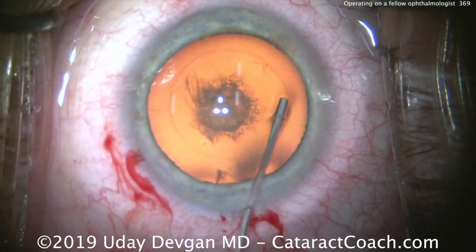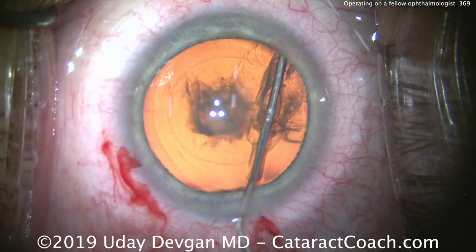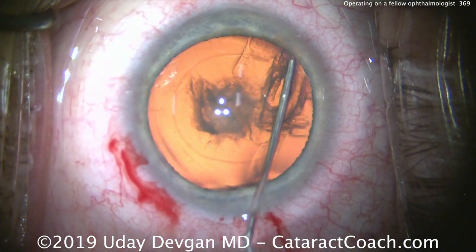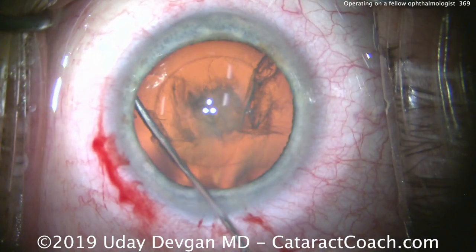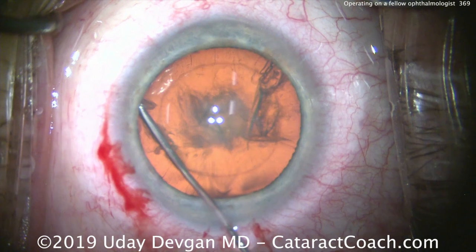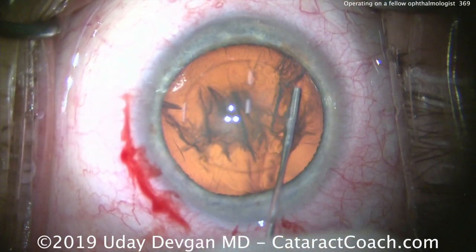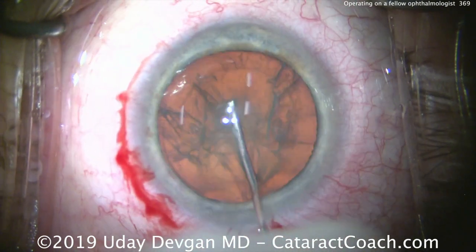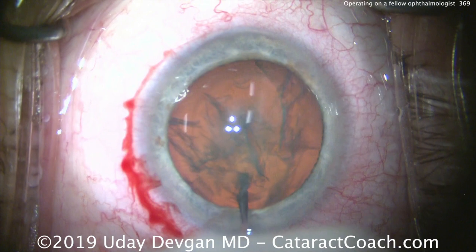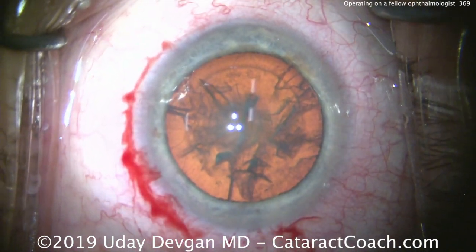So here's the hydrodissection, nice and gentle, watching for the fluid waves to go around. And one of the nice things about operating on a fellow ophthalmologist is lens calculations are very easy. All you do is you ask the patient, what do you want? And that way, he can't blame you later if it ends up being off a little bit. But here's the rotation. Now, only a very little bit of rotation.